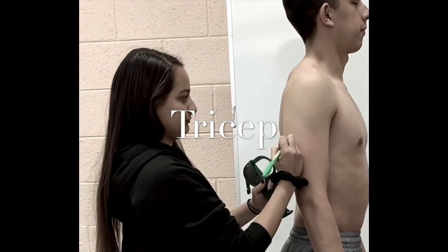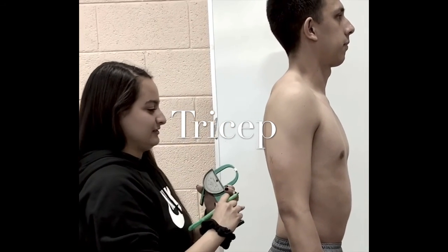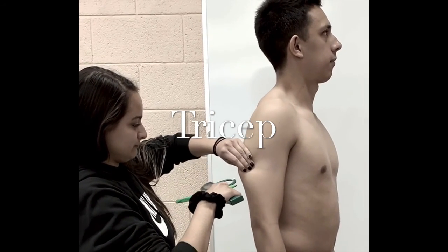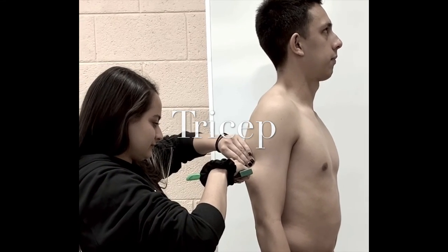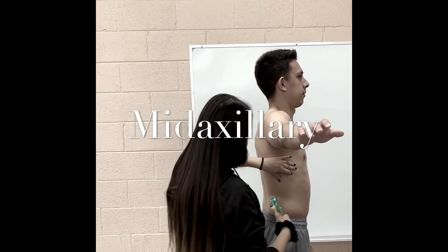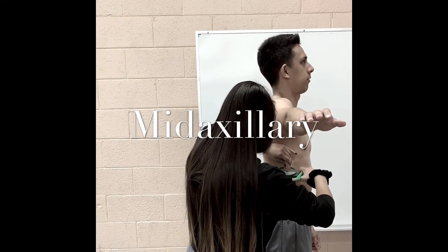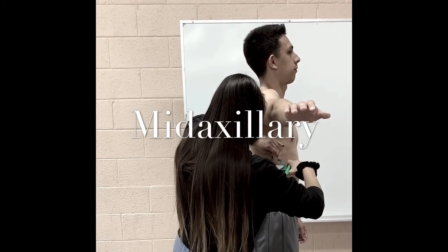The tricep is a vertical fold on the posterior midline of the upper arm, halfway between the acromion and the olecranon processes. The arm should be held freely to the side of the body. The mid-axillary is a vertical fold on the mid-axillary line at the level of the xiphoid process of the sternum. Have your subject stretch his arm out to the right side in order to make it easier to access.